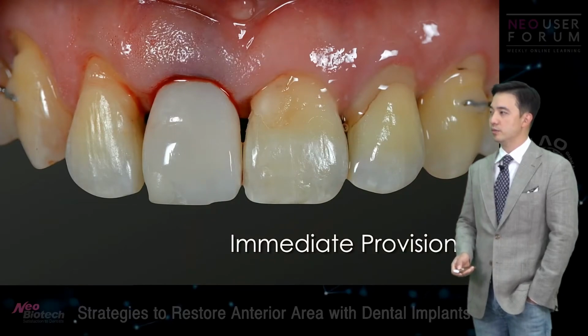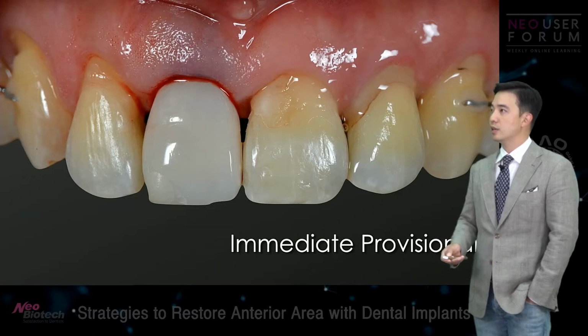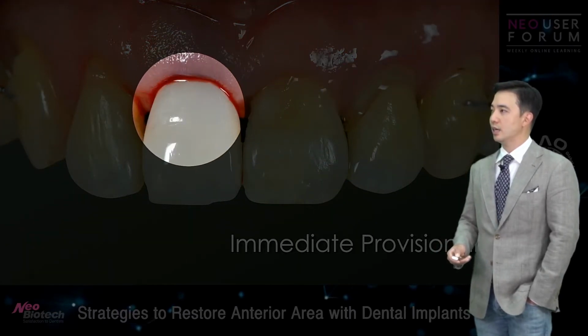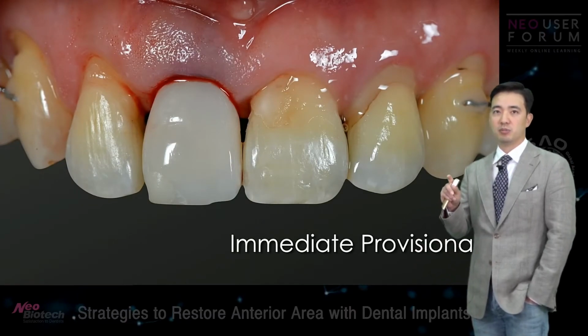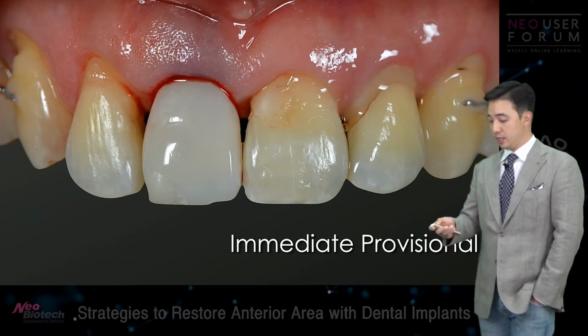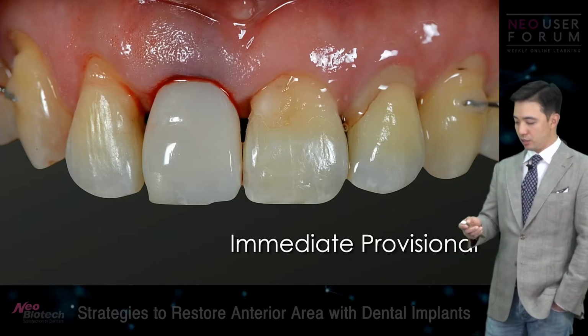Fabricated the immediate provisional. So it's interesting to see how we had an immediate recession after placing the implant.